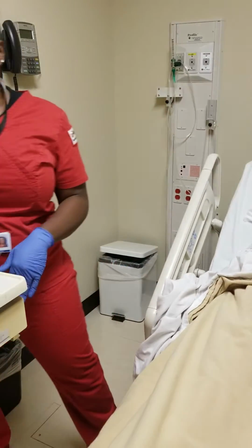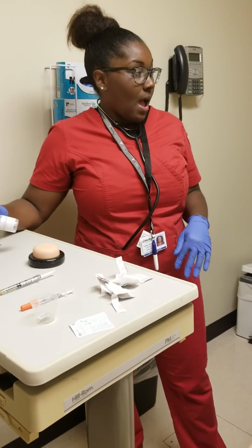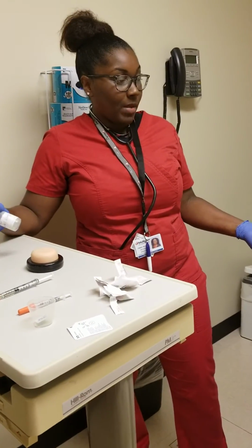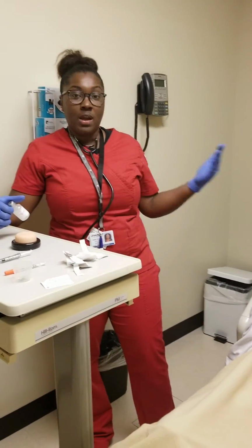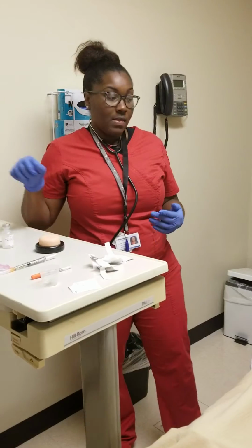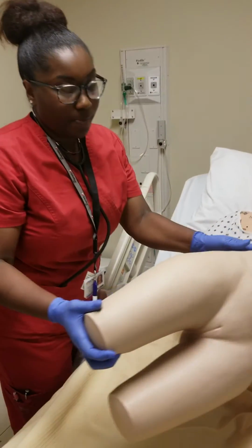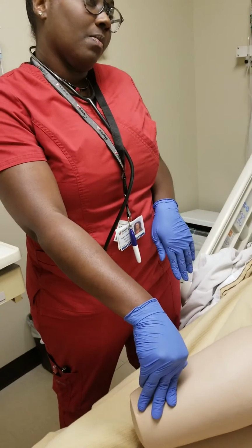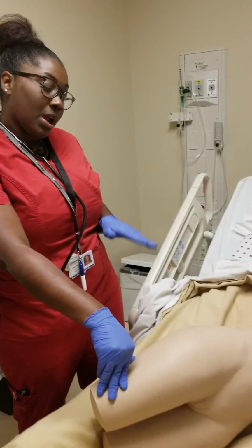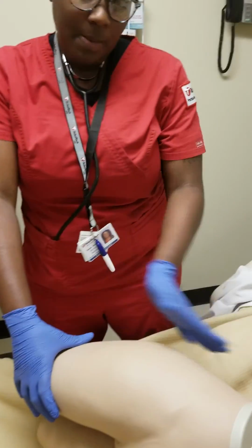The doctor has ordered Toradol 0.5 ml. I inform my patient of that. I check the MAR just to reconfirm that everything's still correct. Make sure I have the correct patient. And this injection I am going to give IM, but I am going to give this on my patient in the ventrogluteal area. So, this is my patient.